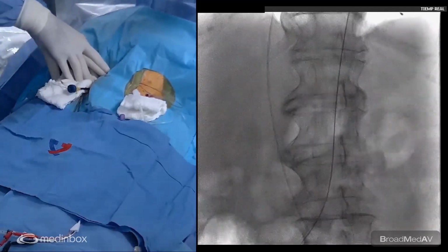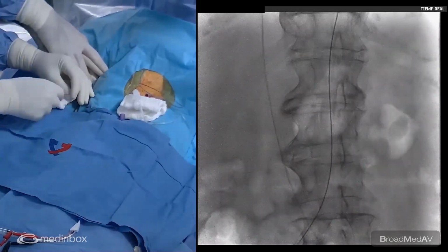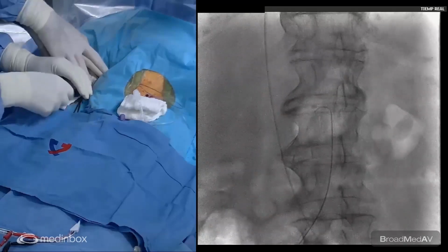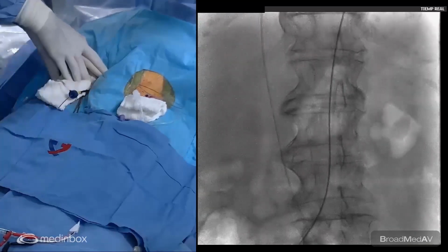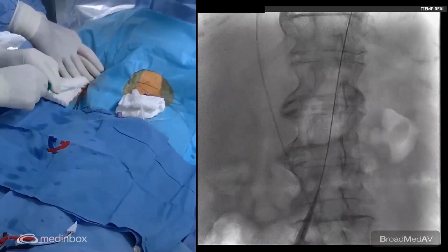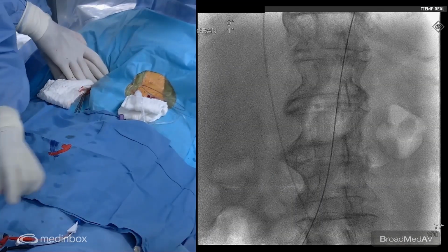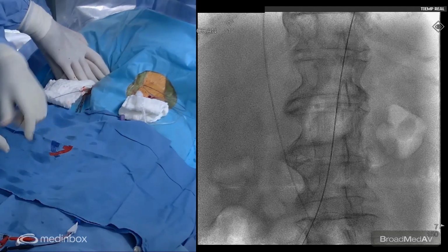So this is very important: whenever we use a large bore introducer, it's important to use a hard wire, extra support wire. So this is also our practice to be sure that we don't have any problem. Okay. So we have dilated the skin and the orifice. And now we put in the introducer, and also Fernando recommended us to suture to fix it.